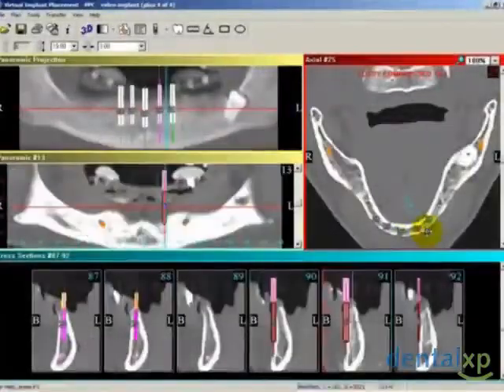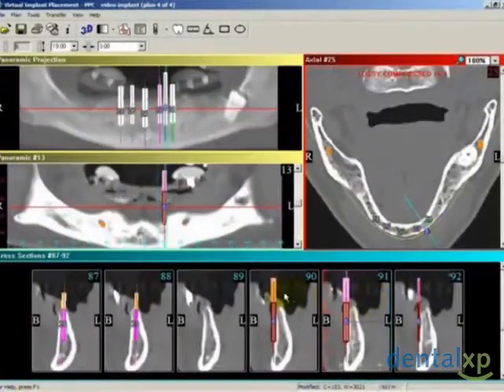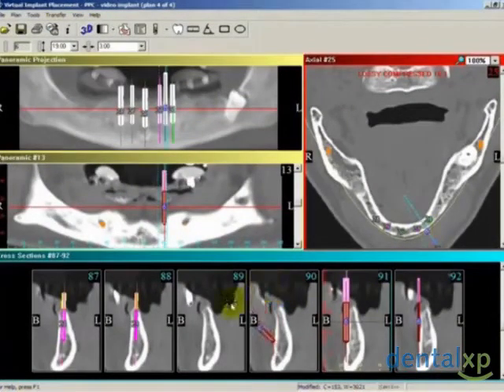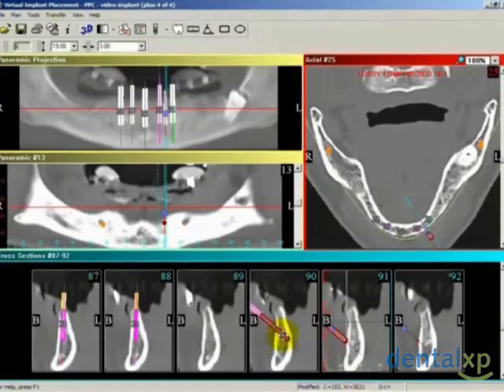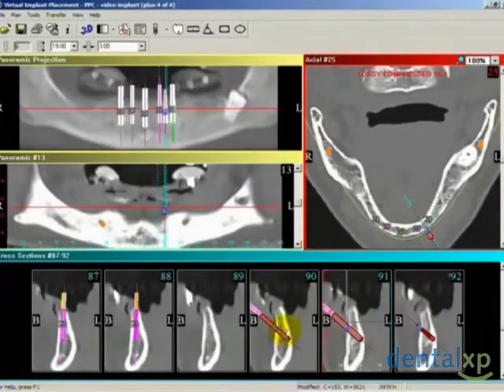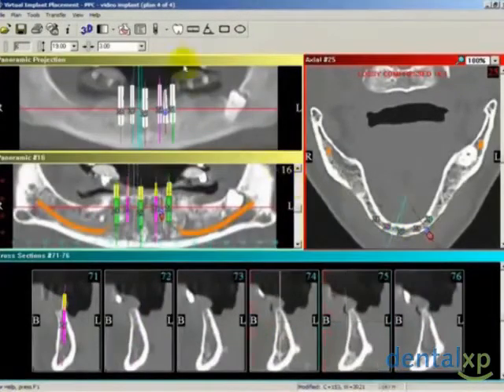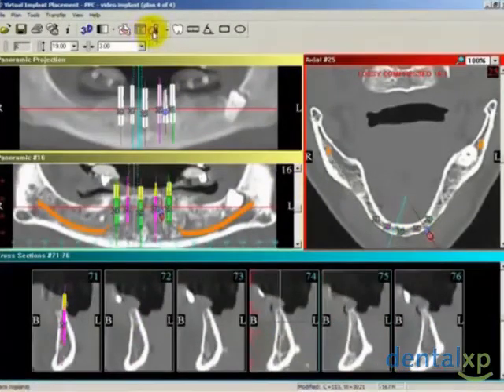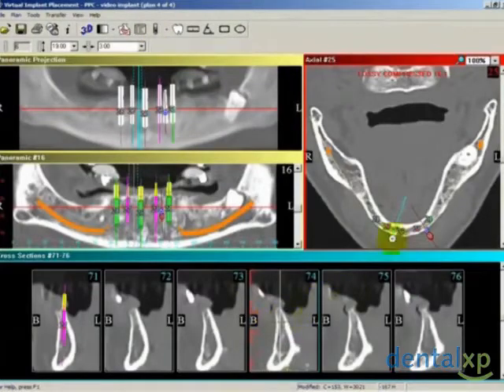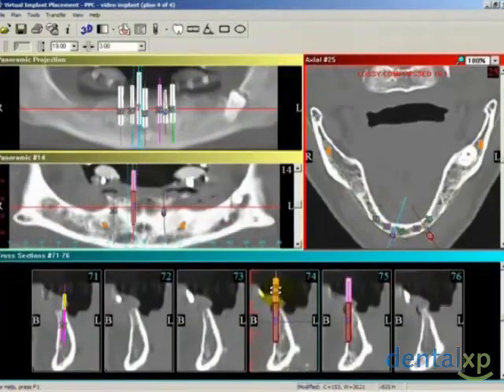In many cases, the surgical guide can be held in place with nothing more than finger pressure. In an edentulous case such as ours, placing pins such as ImplantLogix CompuPins in the guide will yield maximum stability during the surgery. The pins are planned using generic 2 millimeter by 19 millimeter implants and positioned laterally into the alveolus.